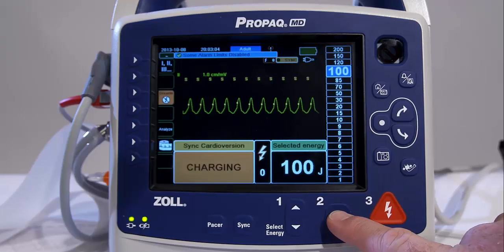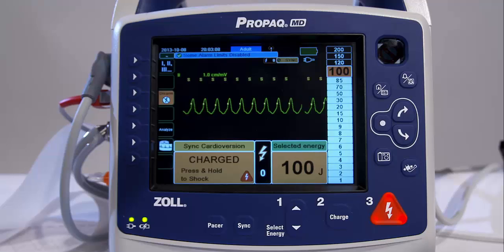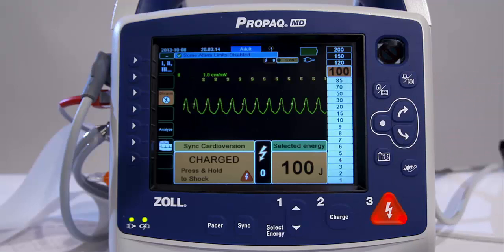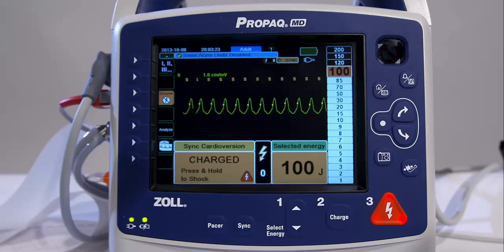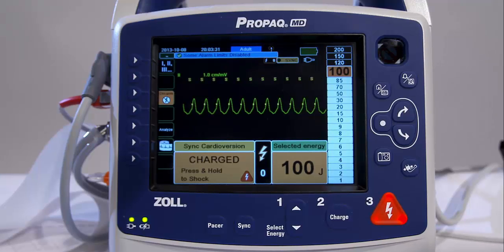Press the Charge button on the front panel. A charging message displays at the bottom of the screen, and a distinctive charging tone sounds, indicating that the unit is charging. You will hear the same tone when the energy level is reached, and the bar graph will also display the energy level. When the unit is fully charged, the tone changes to a continuous charge-ready tone. The highlighted energy bar graph includes the selected energy, and the Shock button lights up.